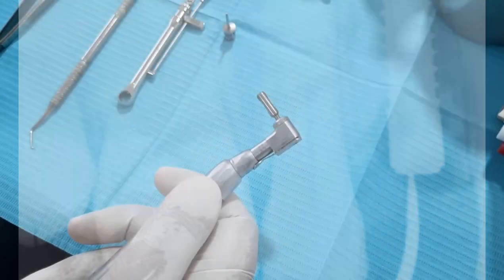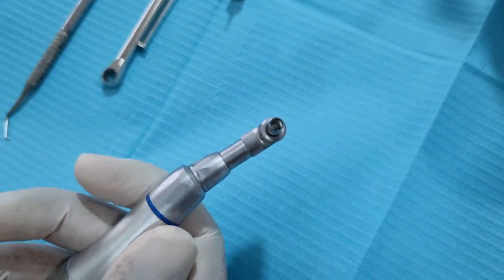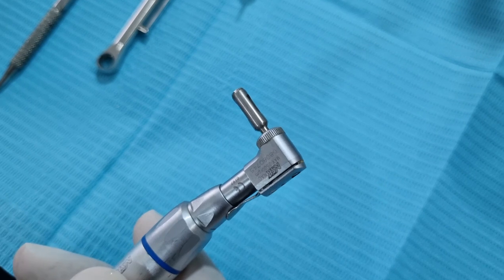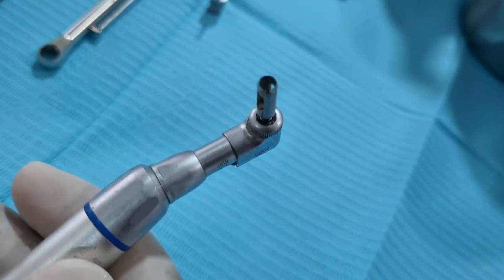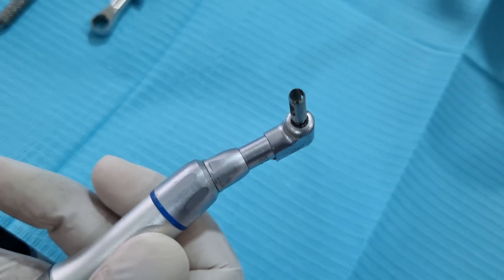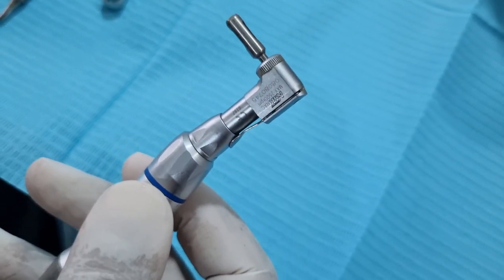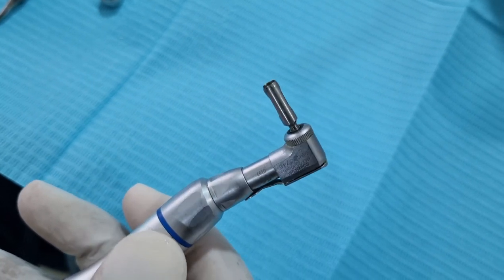This is the tissue punch that I am going to use — it is available in multiple sizes. The size must be equal to or slightly larger than the implant that you have placed. These are trephinated soft tissue cutting drills that will remove the soft tissue above the implant. Although the soft tissue does not separate on its own, you have to use tissue forceps to pull the periosteum off the implant surface.